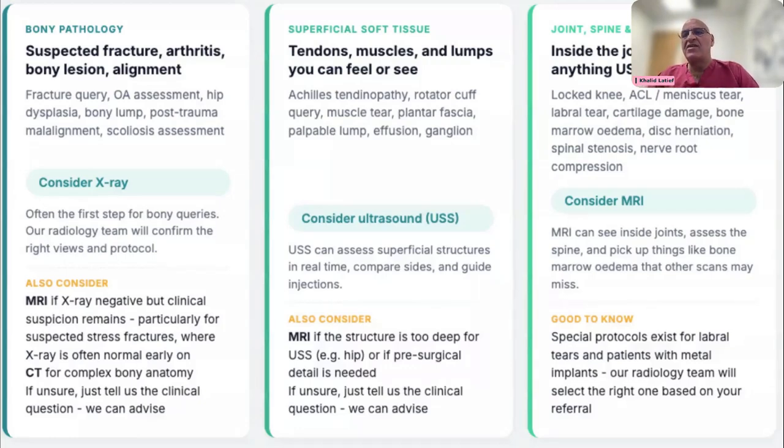We have a specific set of sequences for the shoulder or the hip for the MR to look for the pathology that we want to diagnose, i.e. a Bankart lesion or a SLAP lesion, a labral tear that happens where the biceps tendon attaches. So that's the difference between an MR arthrogram and an MRI. An MR arthrogram is a two-stage procedure, the intervention part and then the MRI part, whereas MRI itself is just one part. You just lie in the scanner straight away.